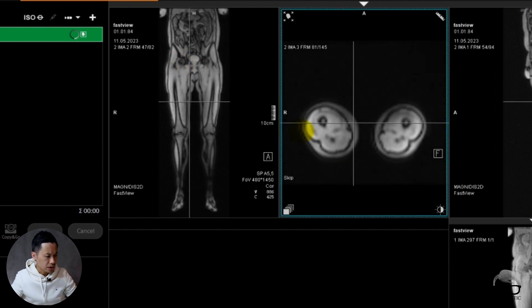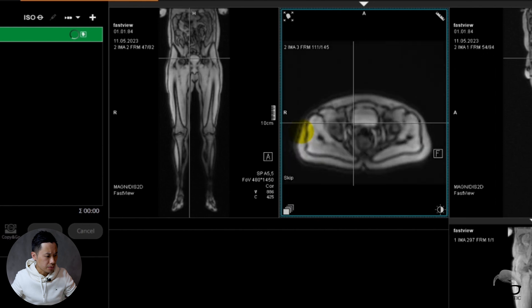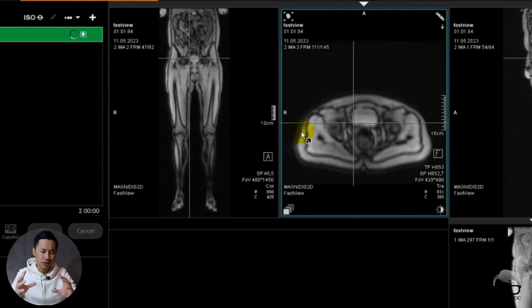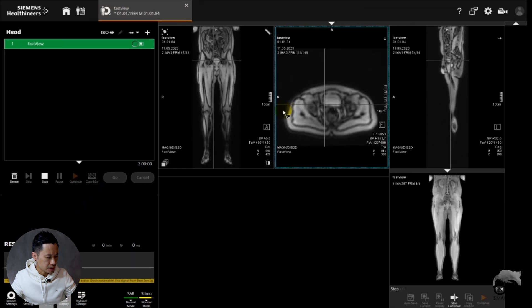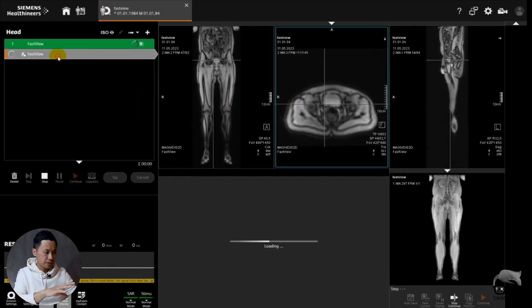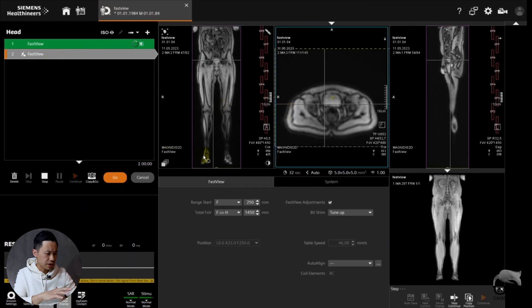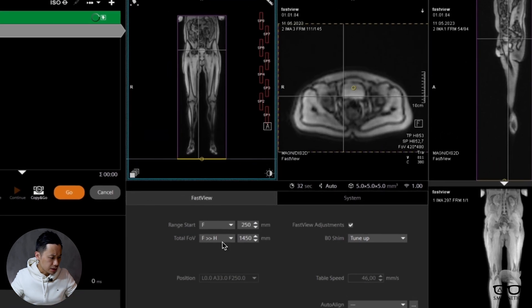We can go up there and we can see it in the transversal plane whenever you're going to do a positioning of your planes. This was directly from Siemens, so I will try to explain to you now.